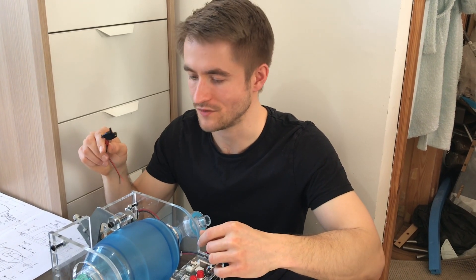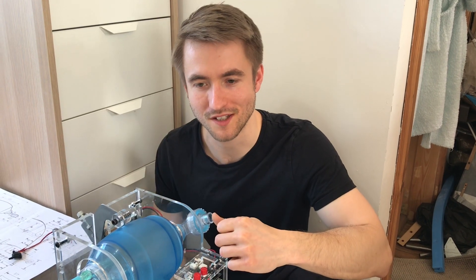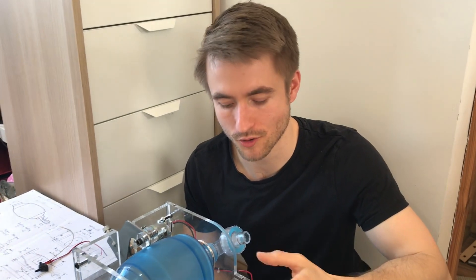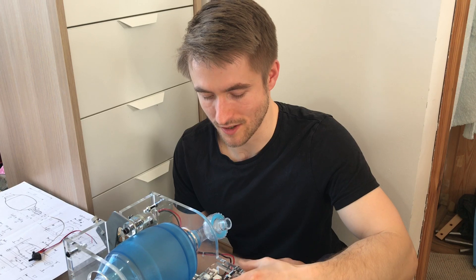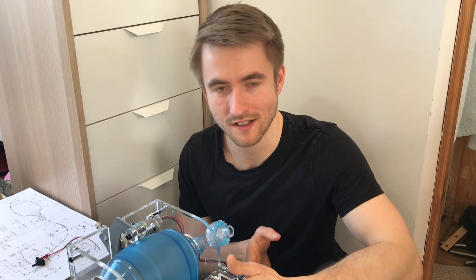I've also got my buddy Sam helping out with the code, making it safety-critical for safety-critical applications — looking into doing things the right way in the code. I think that's about it in terms of the future improvements.